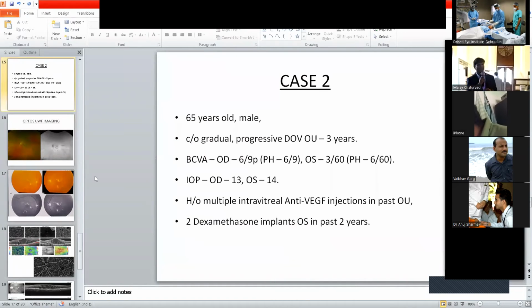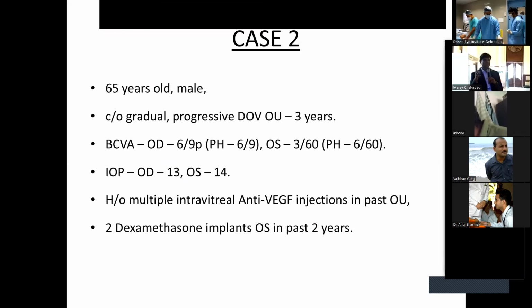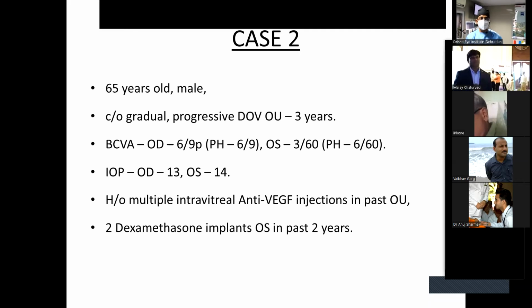It was very nice to see the overall procedure. So my simple first question is pre and post antibiotic. What do you prefer and for how long after intravitreal injection? Yeah, so when I was in the States and we used to give these intravitreal injections, the patient used to just walk into the OPD, get the injection and just walk out without any need for any antibiotics, and sometimes to the extent that even topical antibiotics were not used.